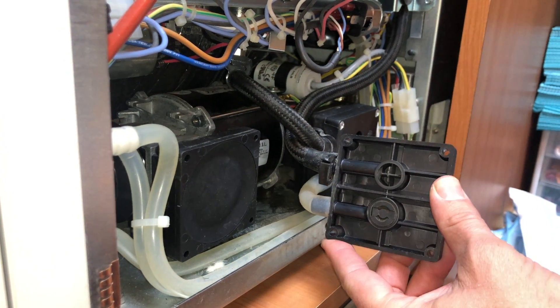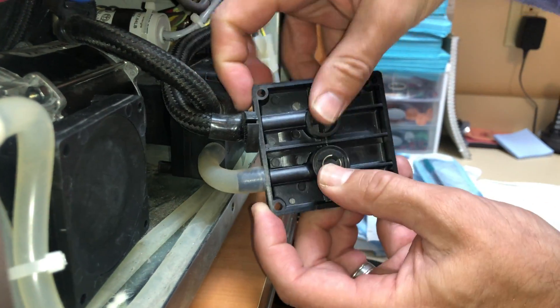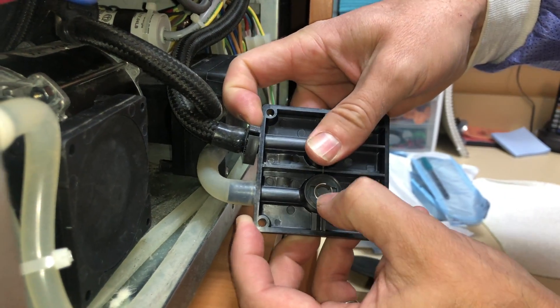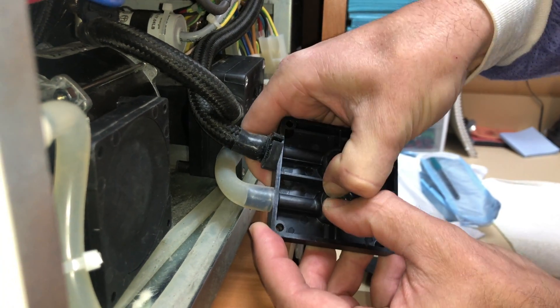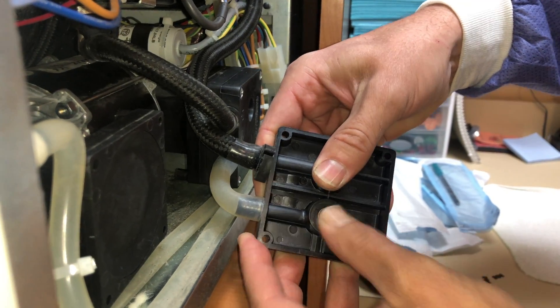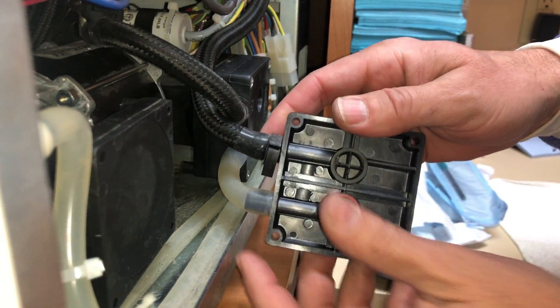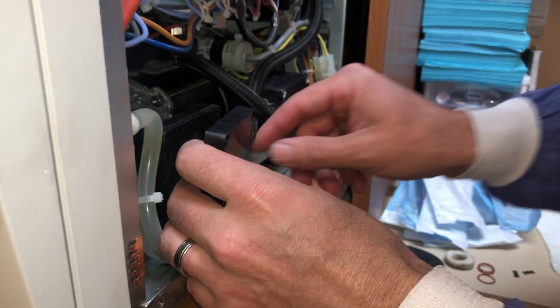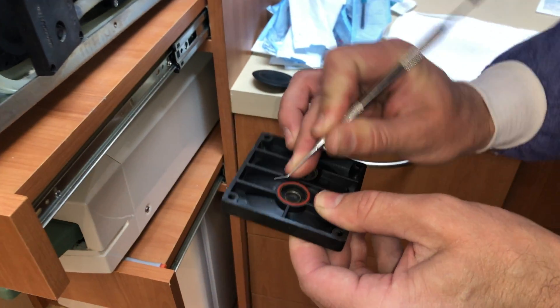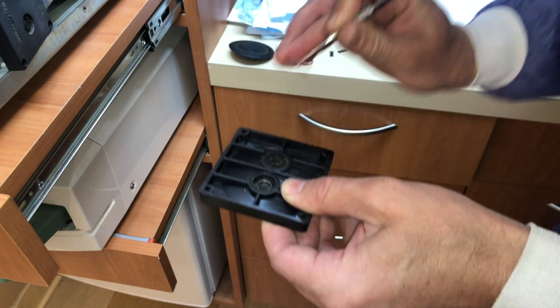Sometimes getting the snap ring in is the hard part. That one went in not too bad. Then we put on our new O-ring and reassemble. Before that, we've got to put the middle piece on — the piece has the same thing. You've got to do the O-ring, the clip, and the diaphragm.